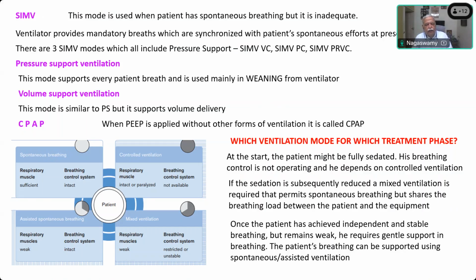Ultimately, your aim is to deliver the tidal volume, maintain the oxygenation, and eliminate the carbon dioxide. Okay?